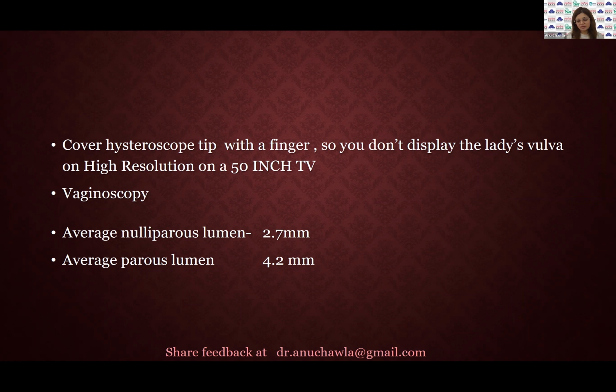Obviously, in the office hysteroscopy, the patient is awake, so dignity and gentleness are the key. When we are starting, definitely cover the tip of your hysteroscope with the finger till you actually start the vaginoscopy, because no one wants to be putting someone's private parts on the 50-inch TV with a high resolution. Vaginoscopy should be done. Speculums should preferably not be put. If they can be avoided, they should be avoided.